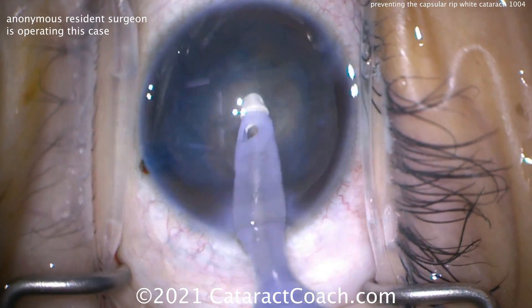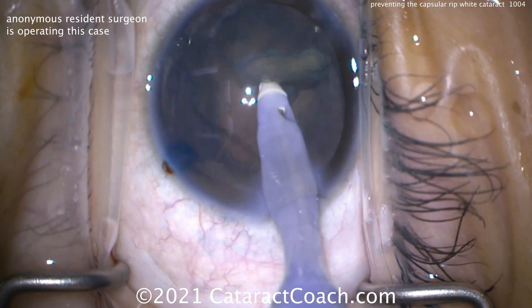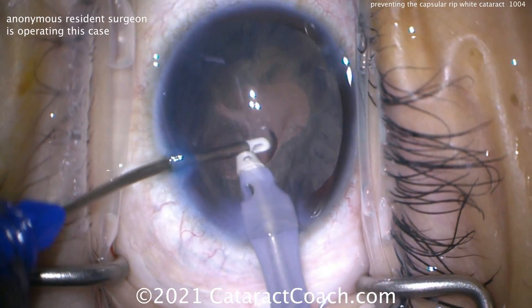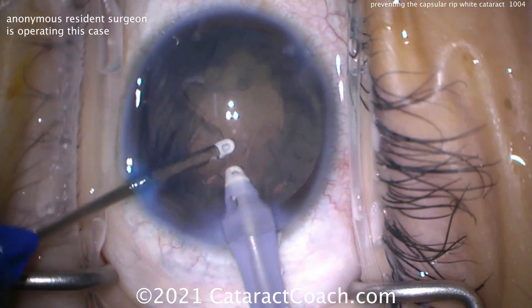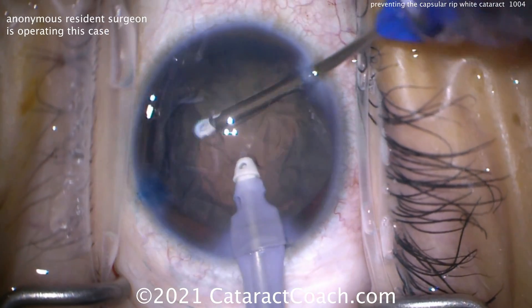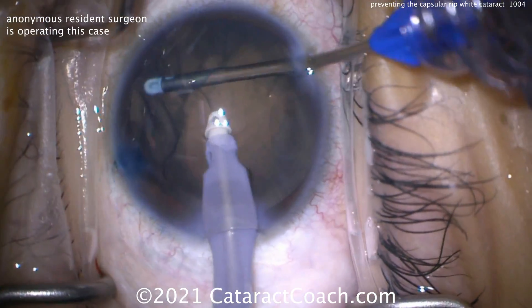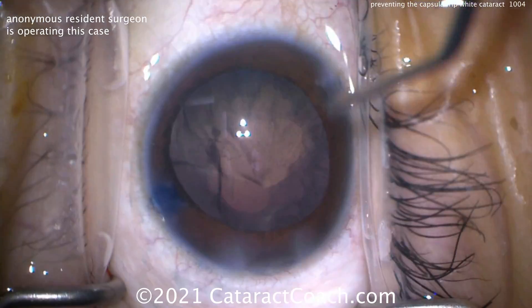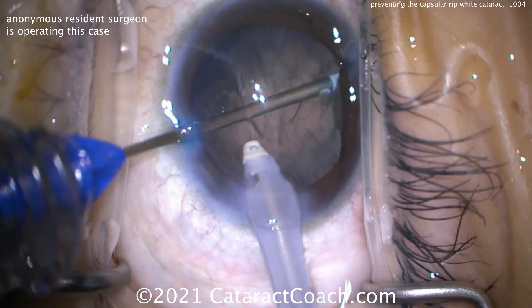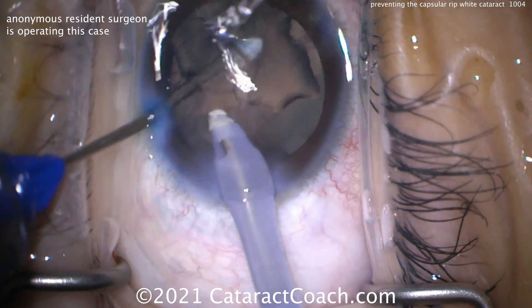Now we can go inside using the phaco probe. This lens is soft — it's not dense — and we're removing the whole lens just with the phaco probe. Cortex removal coming up. We can do a bimanual approach, which is going to be helpful because it's a small rhexis. This is not going to be the final rhexis; we're not going to leave it like this. But we want to clean up as much of the lens cortex as we can. The bimanual approach uses the transformer IA handpiece.